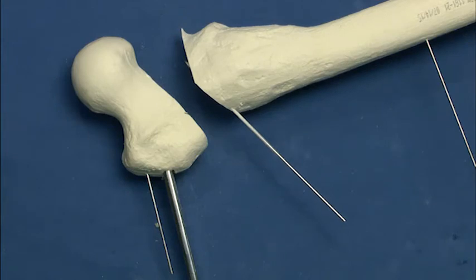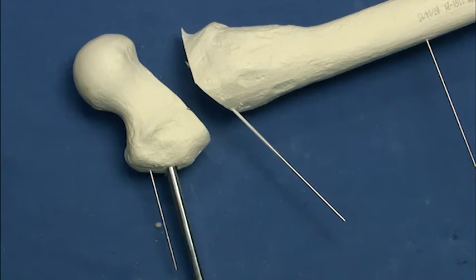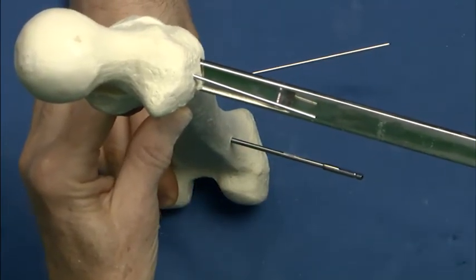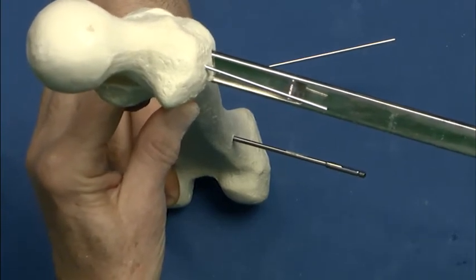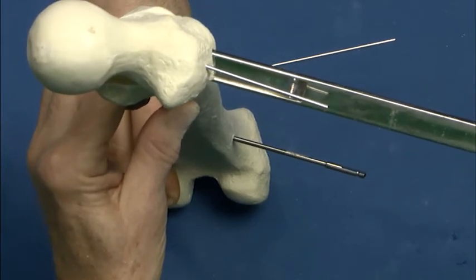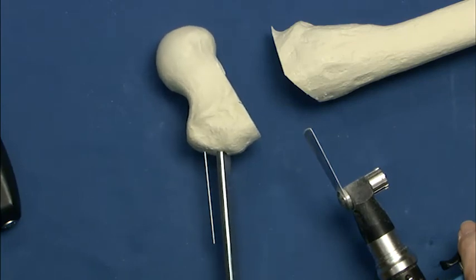And so hopefully now as we superimpose these, we'll have normal torsion, and the only thing we'll have left will be our sagittal plane correction, which will come from a secondary osteotomy from the proximal segment. So this is now our horizontal plane. So we're parallel. So theoretically, once we're done with this construct and we're plated, the total torsional profile of the proximal femur is going to be normalized to about 15 degrees.